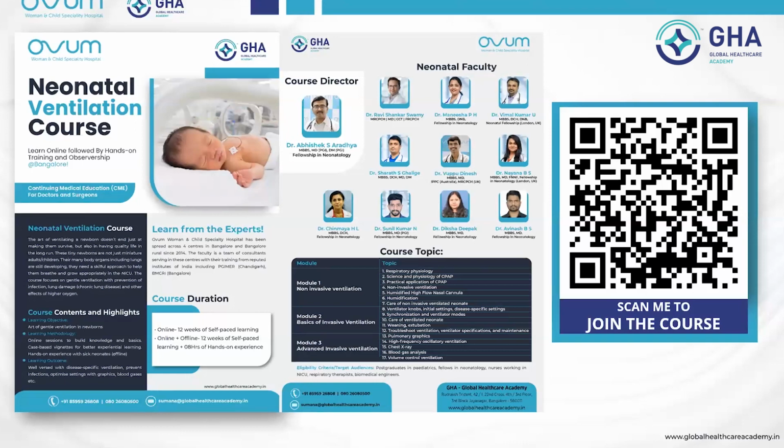They're asking what's the time frame to escalate from CPAP to NIV in case of failure? There is no time frame. It is all dynamic. Before saying failure, you need to ensure that everything possible has been done as far as CPAP is concerned, as well as surfactant is given, caffeine is given, developmental supportive care, everything has been done. In spite of all this, if the pressure requirement is more than 7, and if FiO2 requirement is more than 60%, or if the baby has recurrent apneas, or is hemodynamically unstable, then only go for ventilation. Otherwise, priority should be to continue on CPAP.